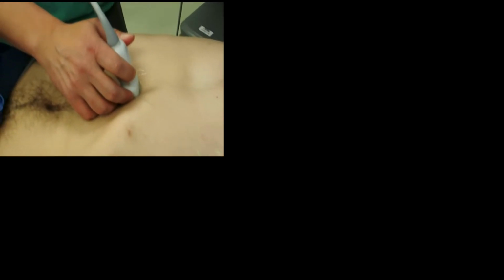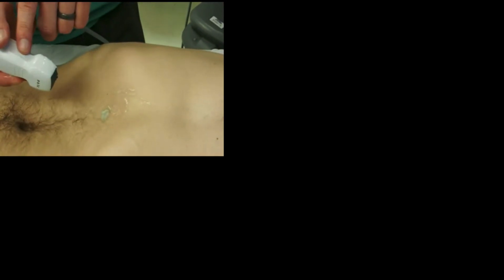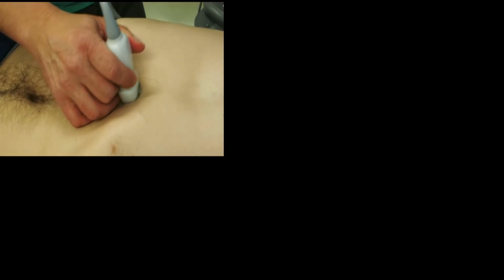So you want to choose either a curvilinear or a phased array probe. Those are those low-frequency probes that will help us see deep into the tissue. You're going to set your exam setting either to a FAST exam or to a general abdominal exam. You're going to take your probe and point the indicator towards the patient's right. That's going to give you that transverse view that you want to see initially.